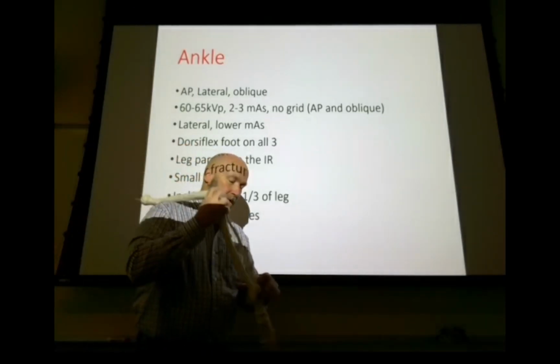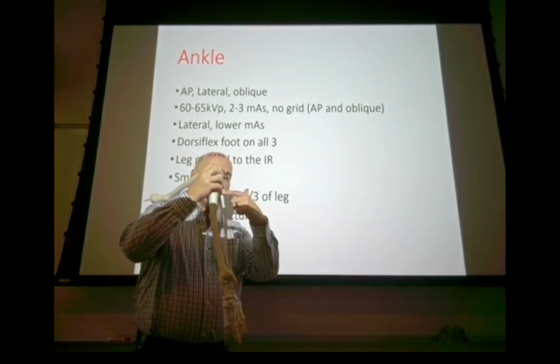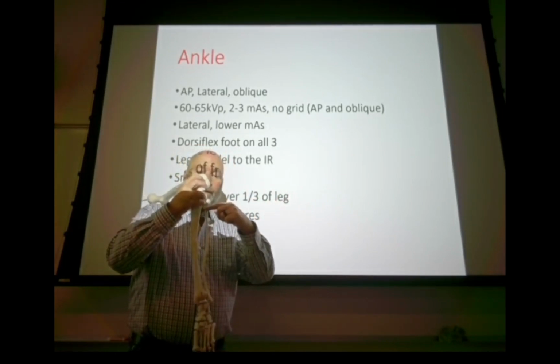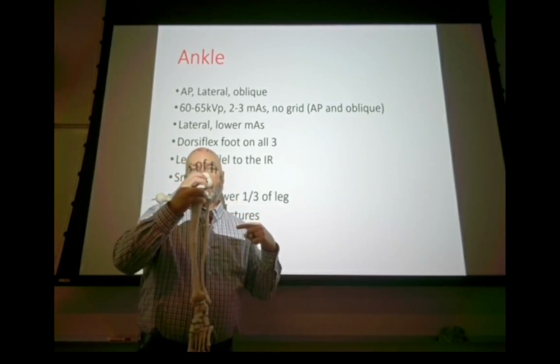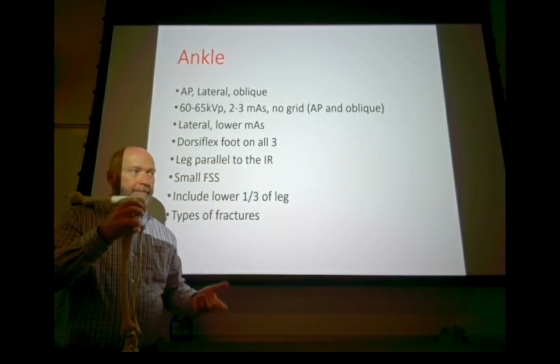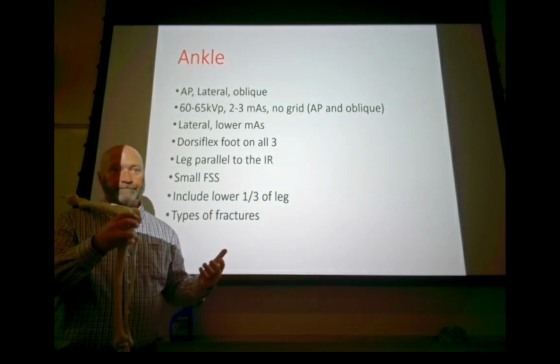In that case, what has happened most likely is that the syndesmosis is torn all the way up, and it's technically an ankle fracture, but there are no broken bones in the ankle, and that would be where you've fractured the proximal portion of the fibula. Okay, so if you have a patient like that, I've only seen it twice. If you have a patient like that, go ahead and set it down, go talk to your ER doc, and say, I think we need a leg on this patient.